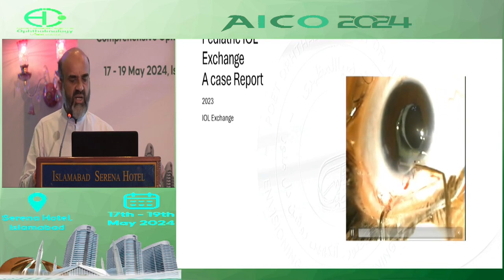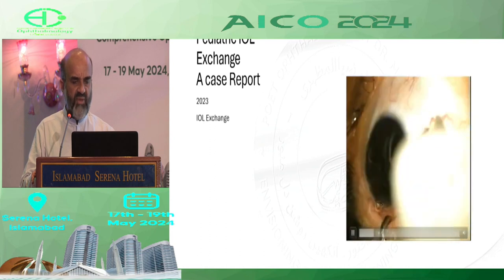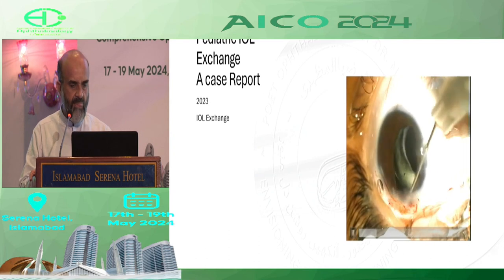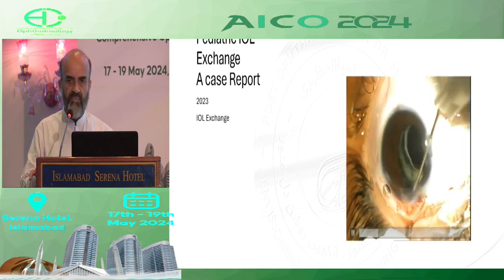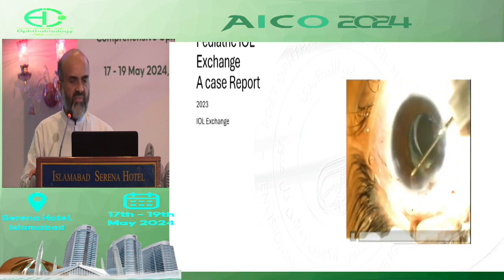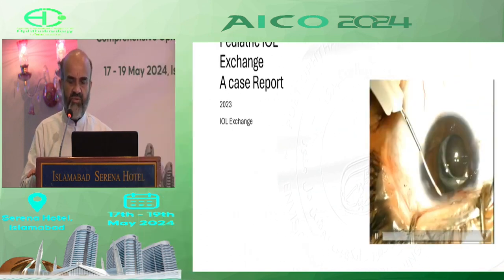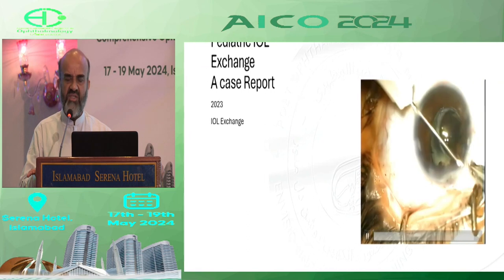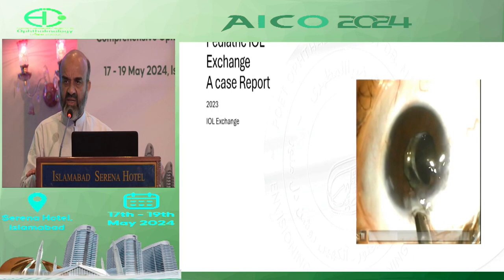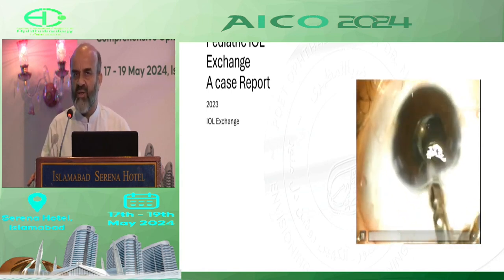And then you dissect the IOL very carefully using visco cannula and Sinskey's hook and T-dialer, and even sometimes you need a cystitome needle to free the iris from the cornea if the synechia are there, and the lens as gently as possible. And you keep on teasing and at the same time taking care not to exercise too much power.